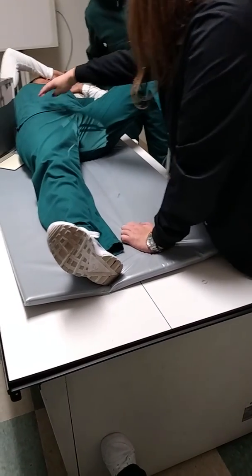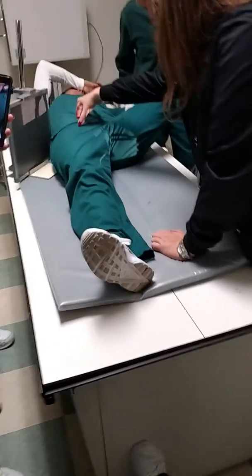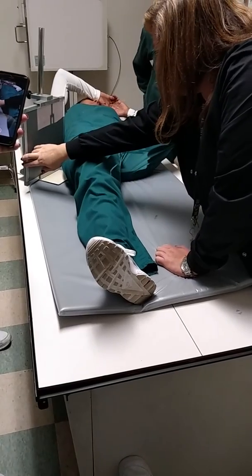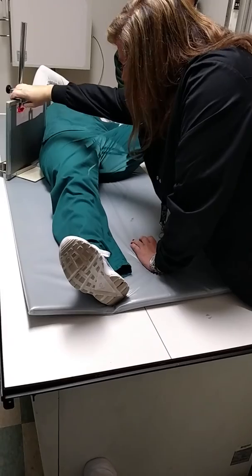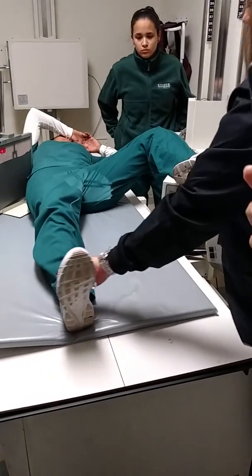All right, so now let me find her femoral neck. It's going to be 1 to 2, 3 to 4, and I'm right on it there. So I'm going to shove this up so that that's in the center. So now I'm getting her femoral neck. It's the tube thing. Everyone's freaking out. I know. Let me get this set, and then I'll show you.